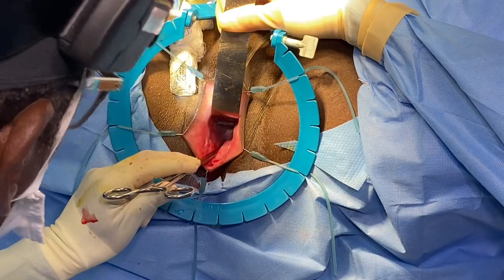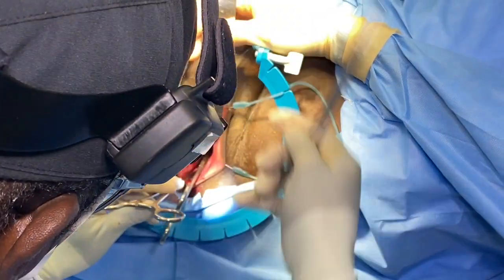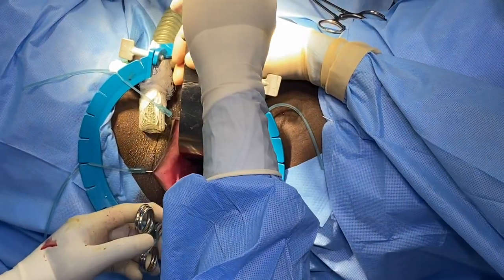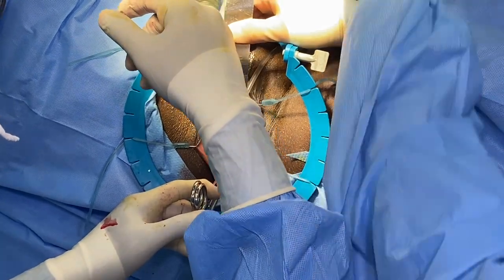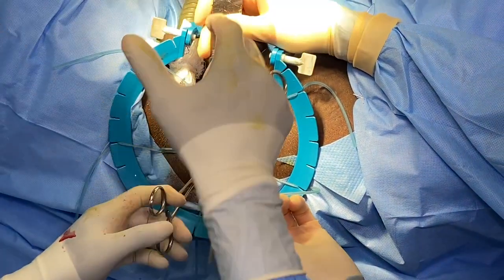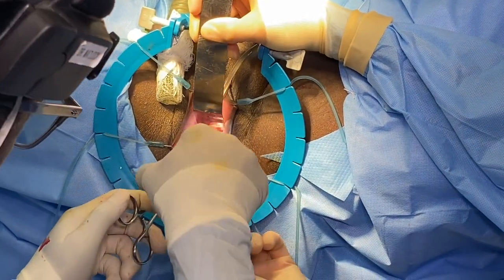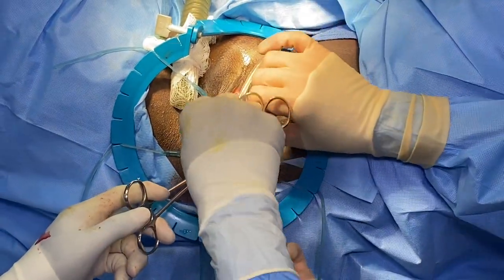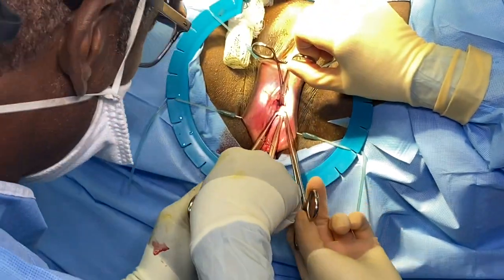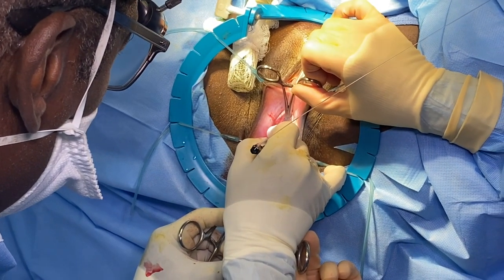Here you go. Put it back there. Two long Allis clamps. You have to open up this mucosa. Metzenbaum. Oh, the long ones? We have an Allis. We're just getting started here. Place an Allis. This is the mucosa. We're opening the mucosa. Undermining the mucosa. Laser. Take the laser. We're going to open up the mucosa here. I've got to be able to get to the muscles.